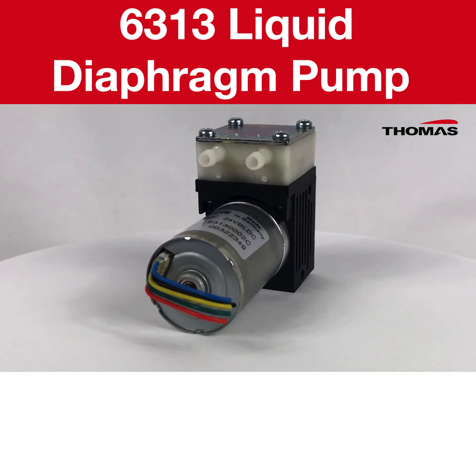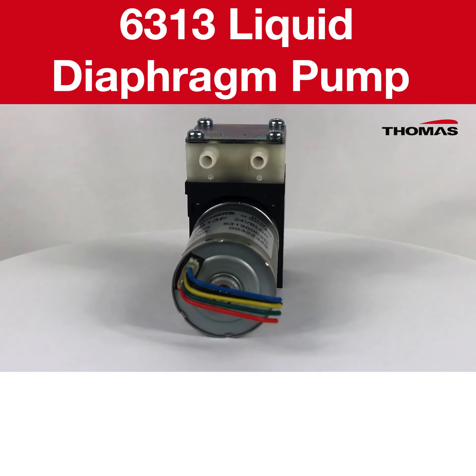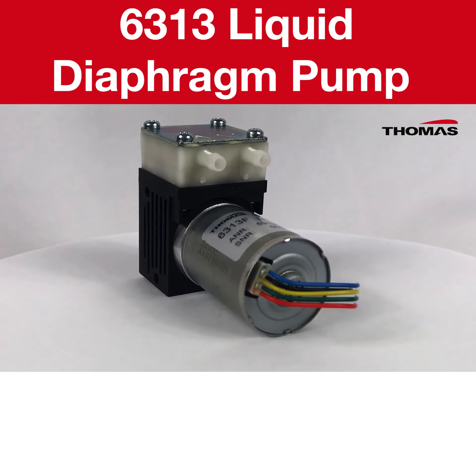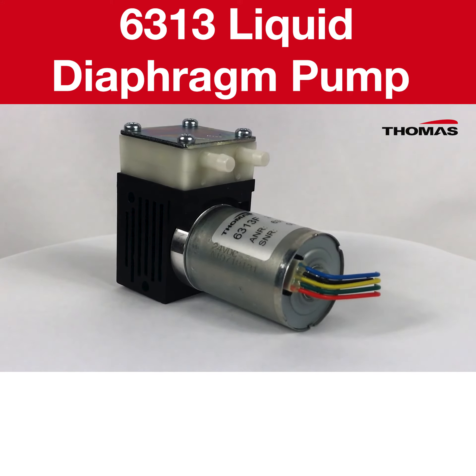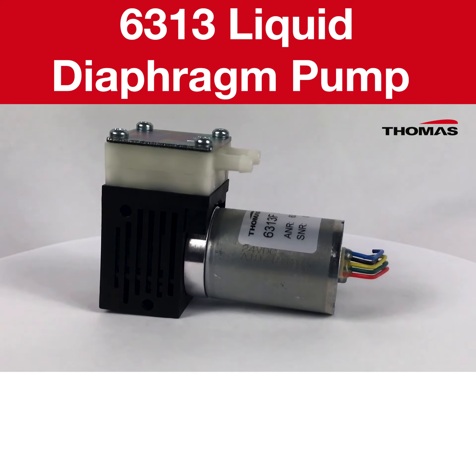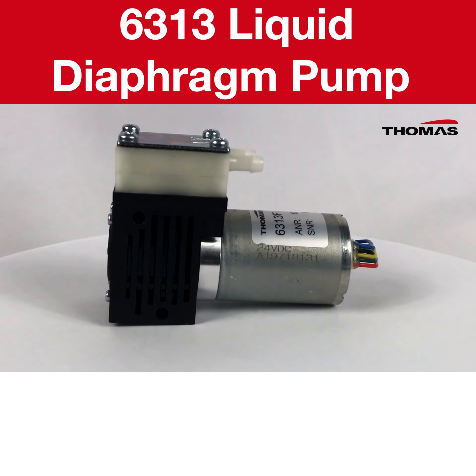So if you are in the diagnostic equipment industry you should definitely be looking into acquiring a 6313 to give you the suction performance and reliability you are looking for. You can download the technical information from the link that we will share with you at the end of this video.